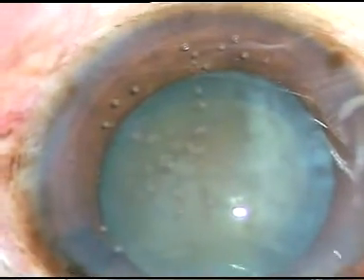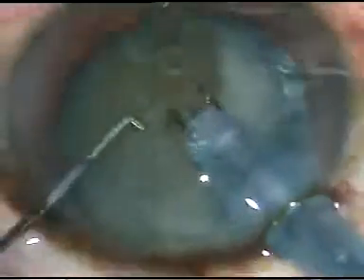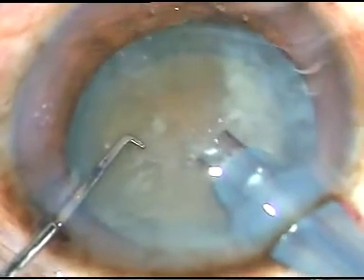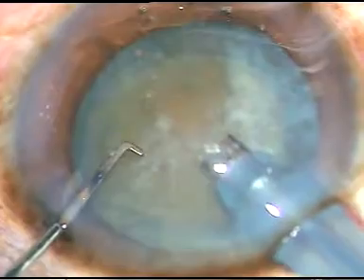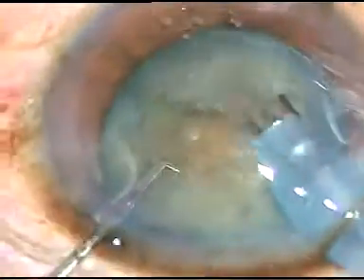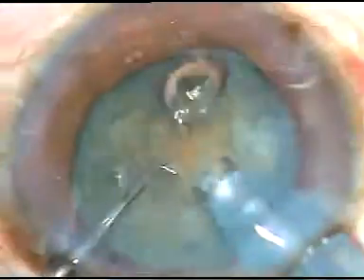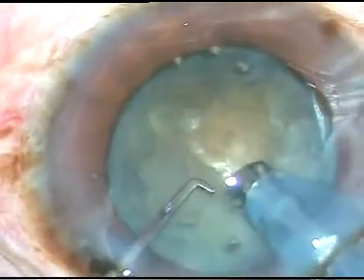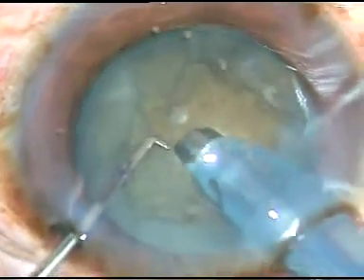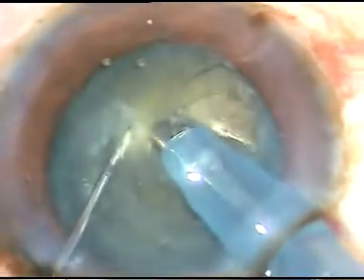Viscoelastic substance is again injected, and now is the time to enter into the eye with the tip of the phaco-handpiece. The superficial lens matter is removed, and in such cases nowadays I do direct chop. In this case, I have not gone very deep into the lens, but I have been able to chop this nucleus.